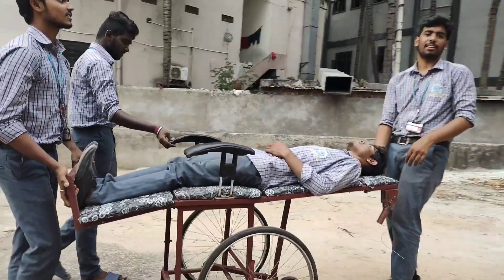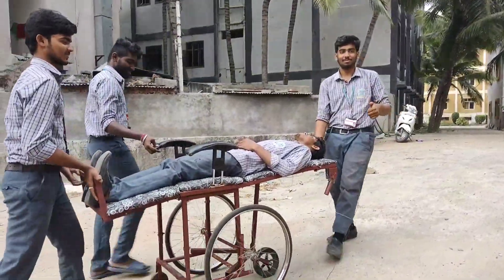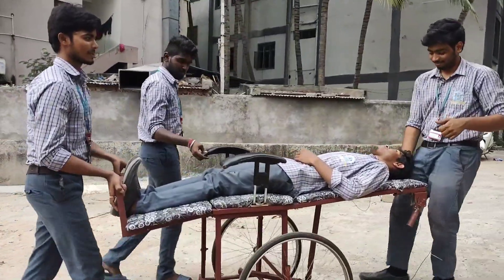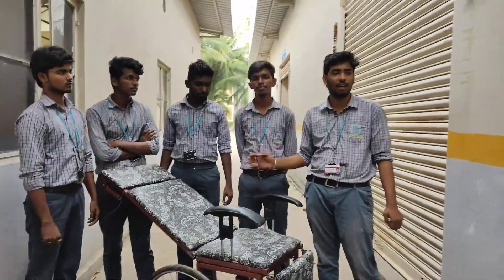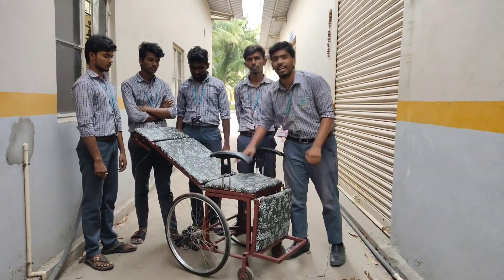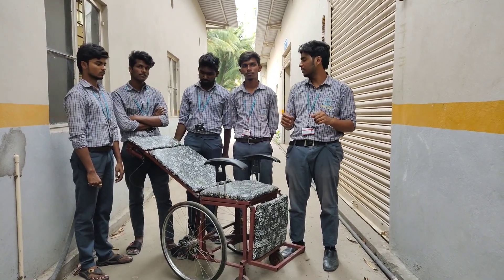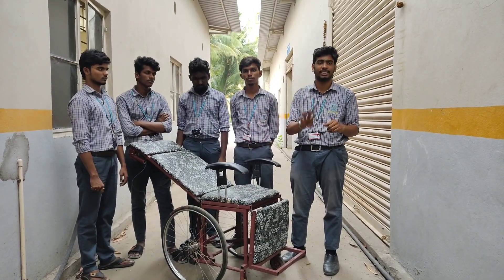We can transport the patient from one place to another with easy and comfort. This project is fabricated to provide normal rest, semi-rest, and a full stretcher mode. It provides complete rest to the patient and allows easy transport from one place to another.